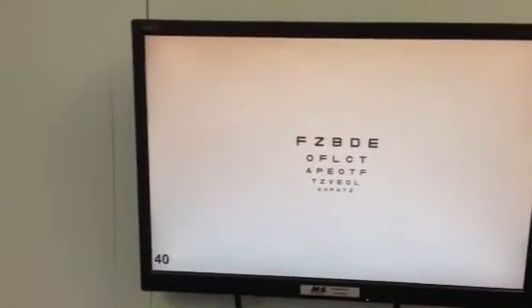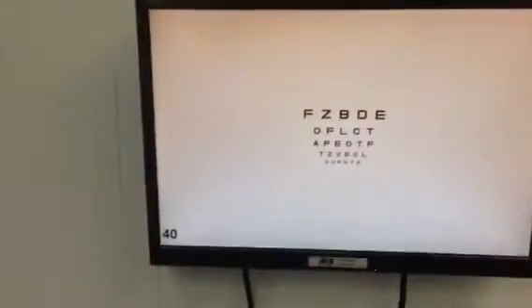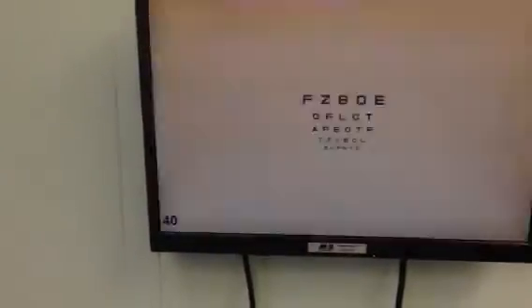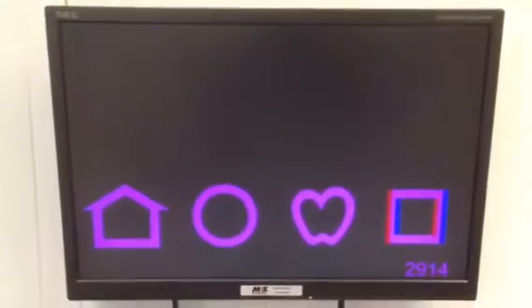So first thing we're going to do is look at Lea Stereo and we've seen what this looks like before. When we're using the touch screen we're going to want to go to the tab here in the middle called Media and then you will see Lea Stereo right up here and it should come up on our screen when we click on it. There it is.